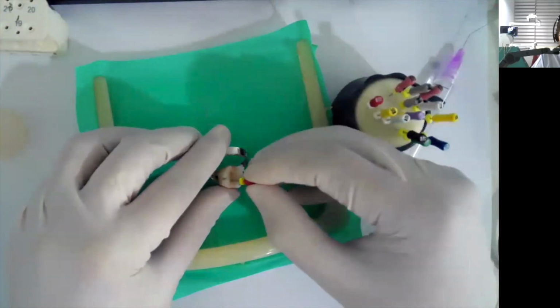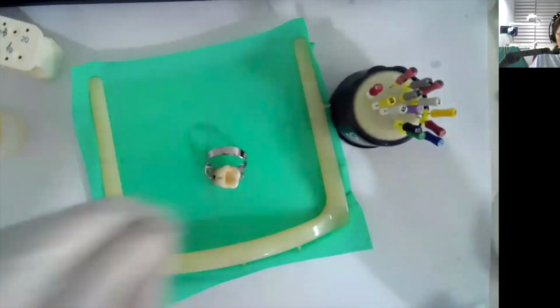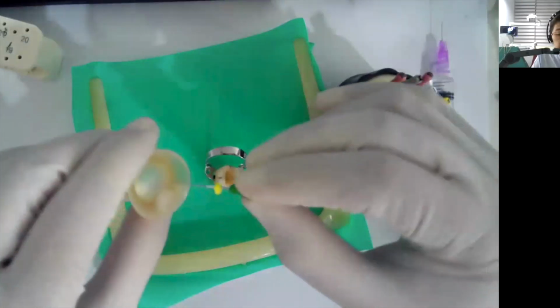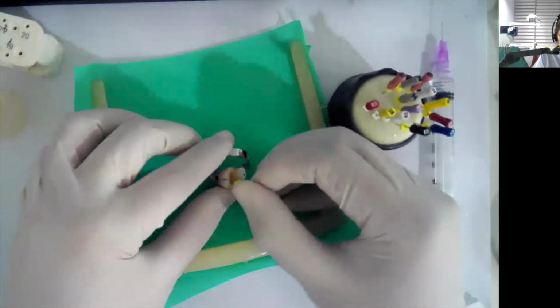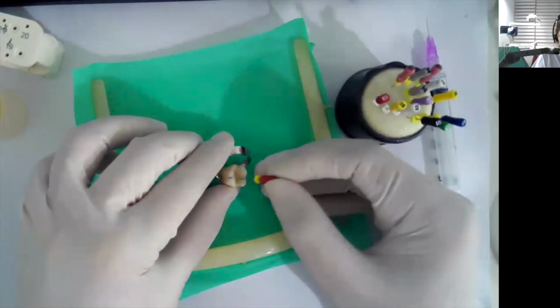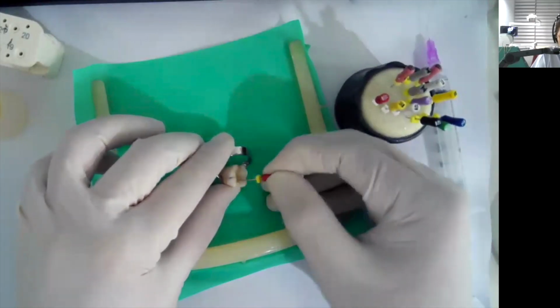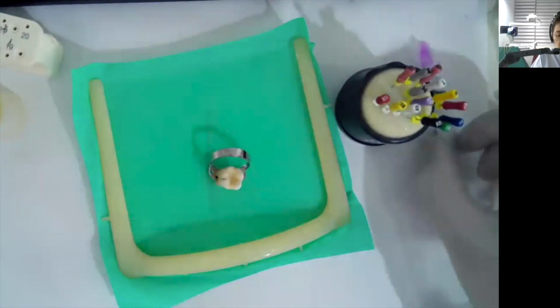So this is now your recapitulation. It's still reaching the length. And then I'll go now to size 35. So this is now 2 millimeters short of the working length. Recapitulate using your MAF at 22.5, which is the working length. Still reaching the length. You remove the step it has created. And then, of course, irrigate.